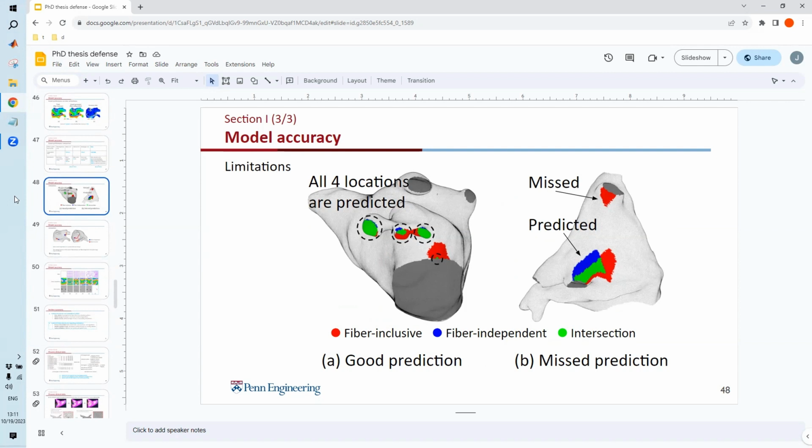Although in figure B it looks like we are missing a large chunk in the distance, let me explain a little more about what this map is. It is the latest local activation locations, so what we are showing is actually the maximum error in the atrium. In clinical practice, we believe the heart model is used by starting from the minimum error regions. Then physicians can do some ablations on that, and then we do another iteration.